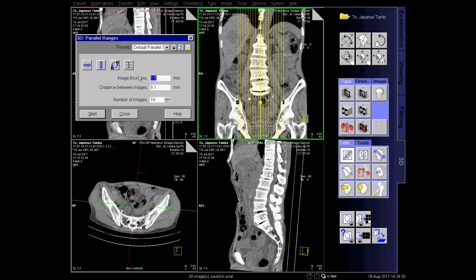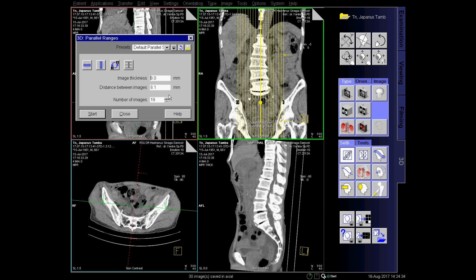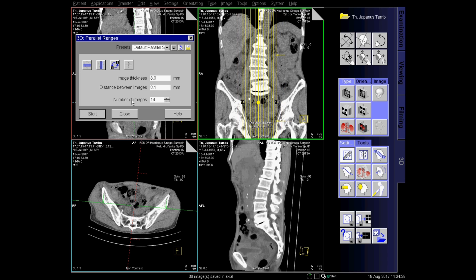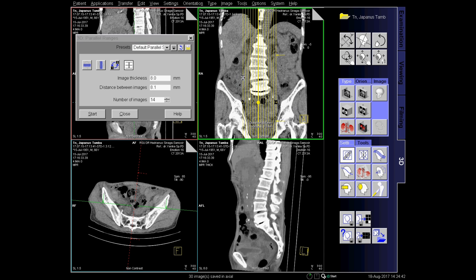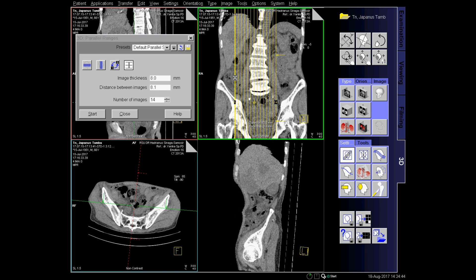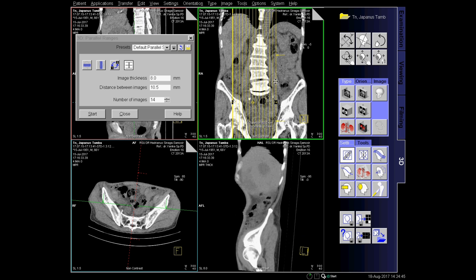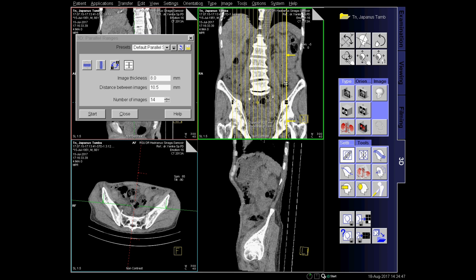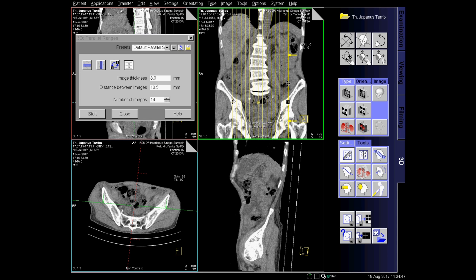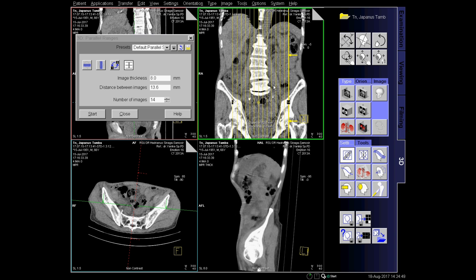Now, as you can see in this video, we continue to make a sagittal cut. We set the parallel range with image thickness equals 8mm and number of images equals 14. Then we set the left border and the right border of the image cutout which we want to include later in the filming menu.